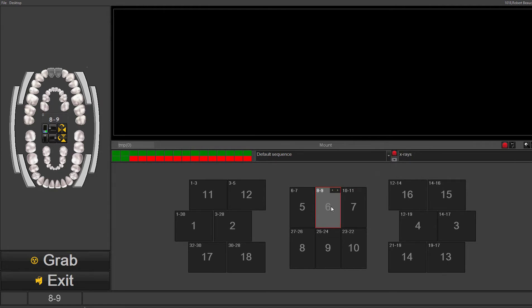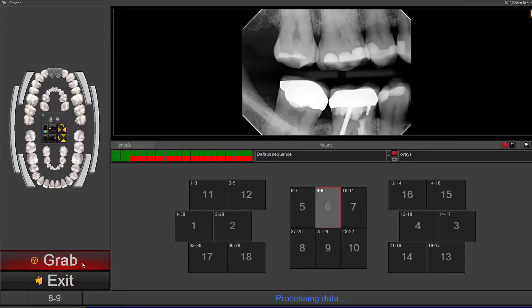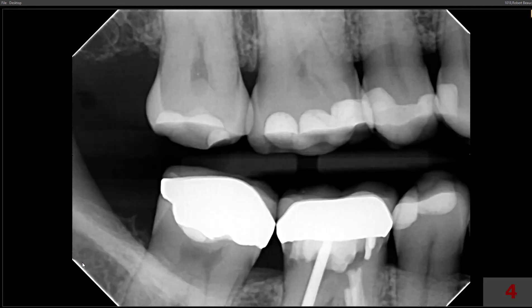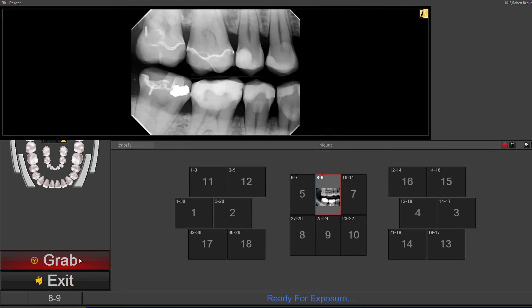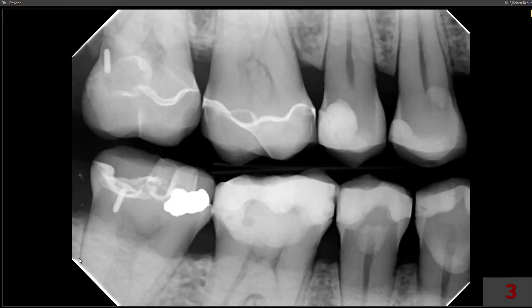— then it will stay on that one tooth, and when you acquire the x-rays, it will take the x-ray and place it in that box. Any x-ray you take again will just be placed on top of the other x-ray chronologically.